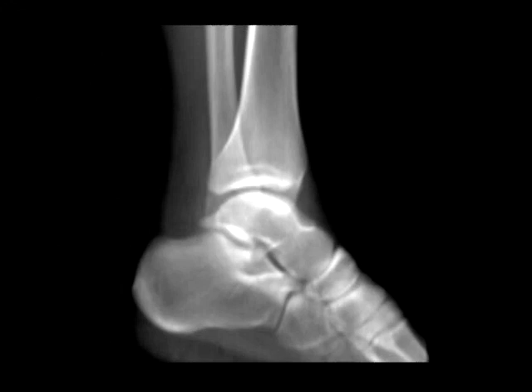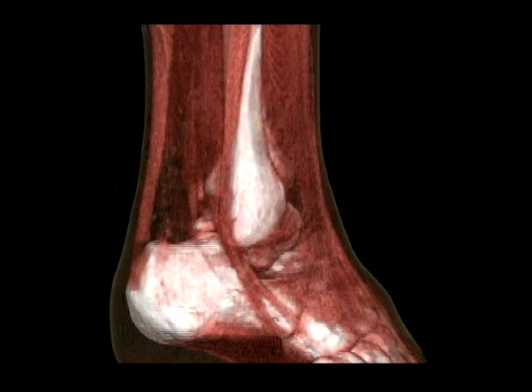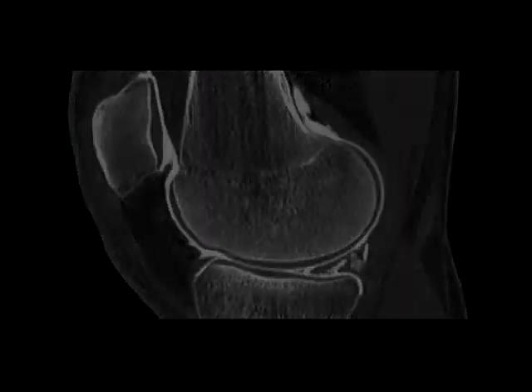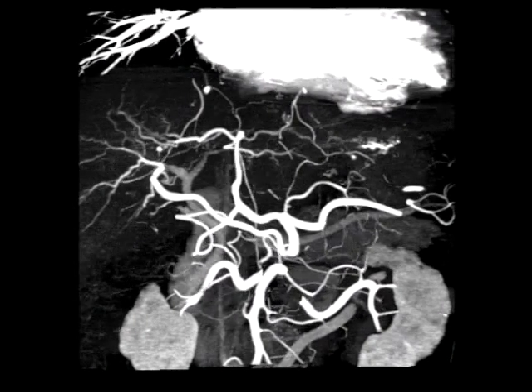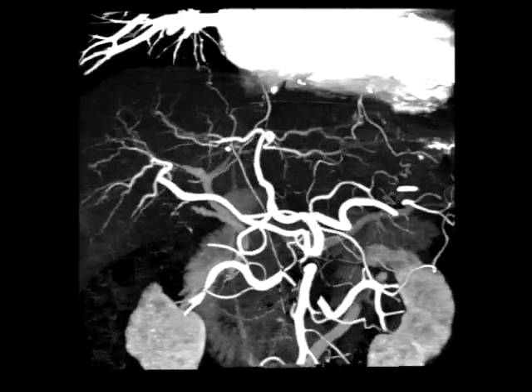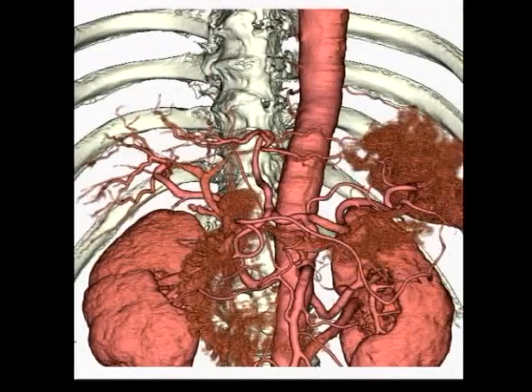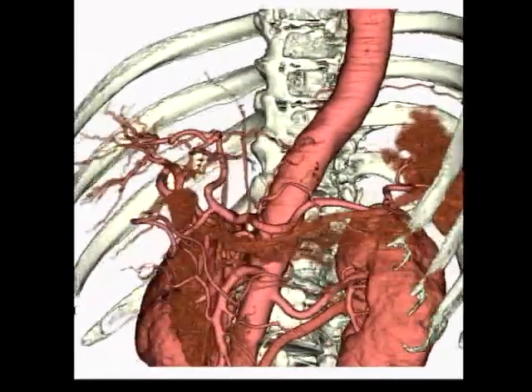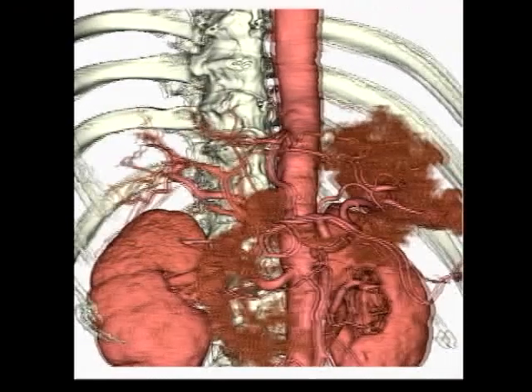In the field of orthopedics, multi-slice CT is being tested as an alternative to plain radiographic imaging. The early arterial phase in the abdomen. High-definition 3D imaging on a par with angiography. This was also acquired using a ½ millimeter slice.